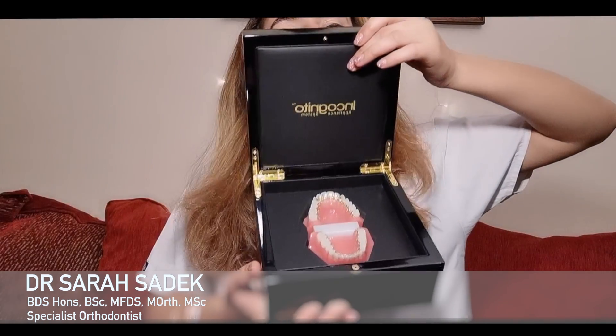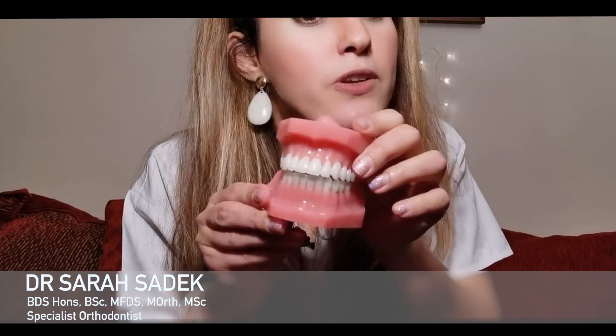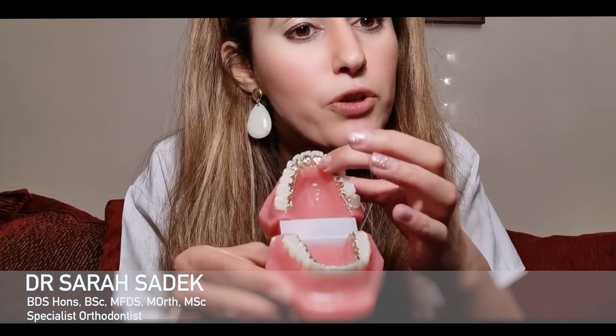Lastly, the other type of fixed brace comes in this wonderful box — or the model at least comes in this wonderful box. What we can see here is that the brackets actually go around the inner surface of your teeth.